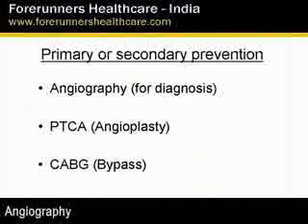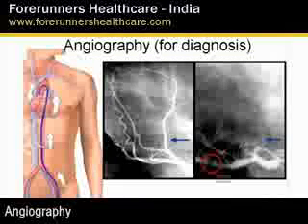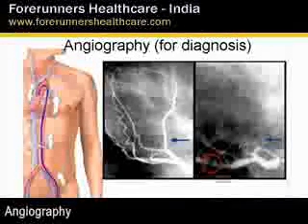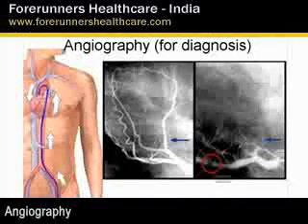Now we will see the three most famous words related to the heart problems: angiography, angioplasty, or bypass surgery. I will start with angiography first. At the very outset, I would like to inform that angiography is meant for diagnosis. It is not a treatment by itself.